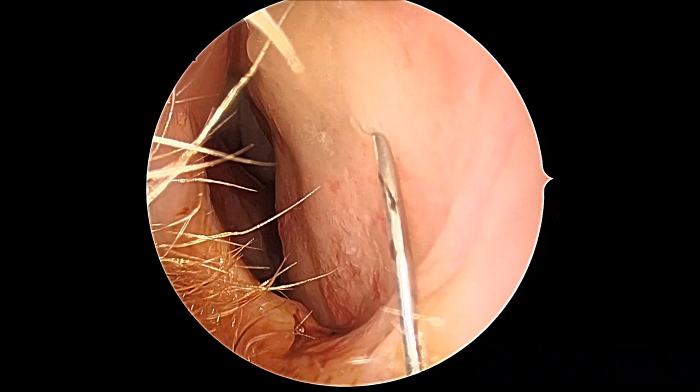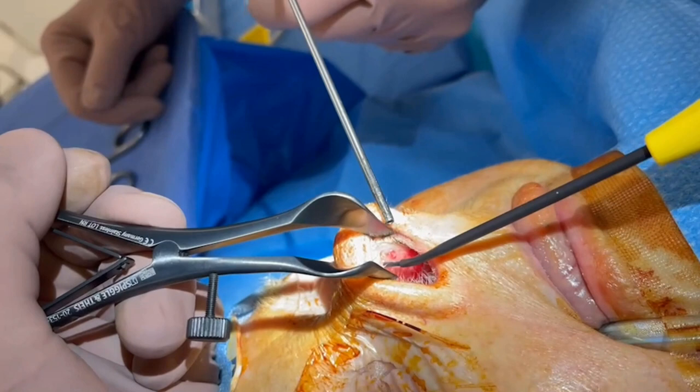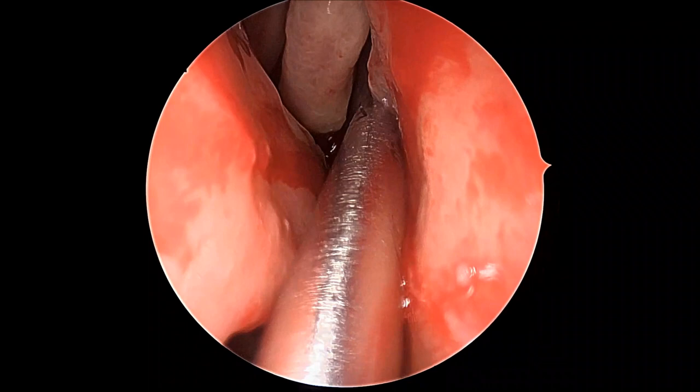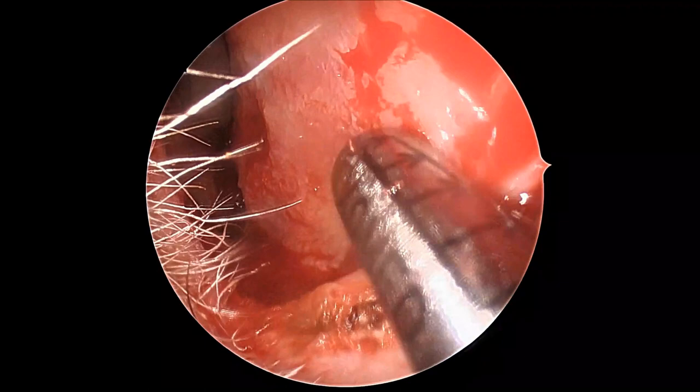Injection occurs with local anesthetic to really bulk up the submucosa. Then the squamous cutaneous junction is defined with diathermy, giving the endoscopic operator a very clear goal of what area needs to be demucosalized. A three and a half millimeter shaver is used to slowly demucosalize the septum and floor right up to that defined squamous mucosal junction.